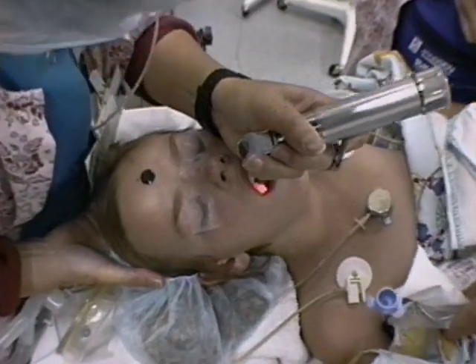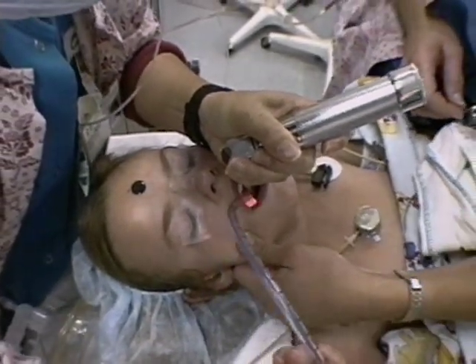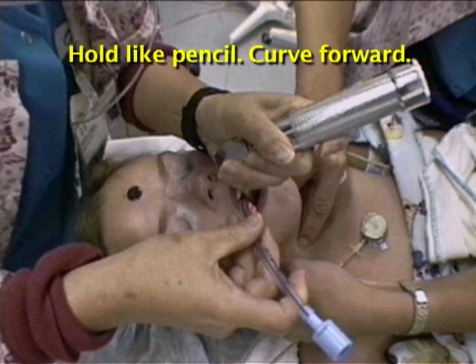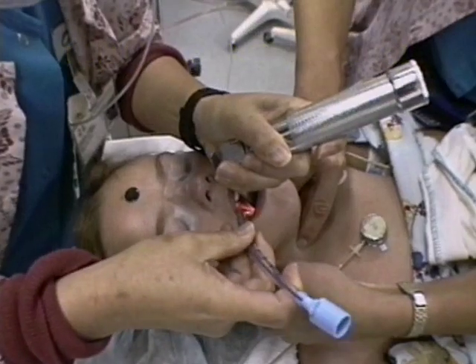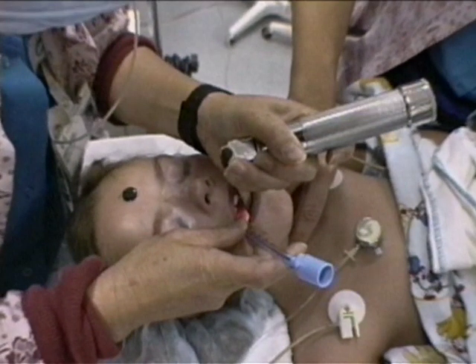Pick up the tube with your right hand. You can also ask your assistant to hand it to you in the correct orientation for insertion. Hold the pre-selected tube in your right hand like a pencil, curve forward. Keep your eyes on the trachea and maintain control of the blade. Insert it to the right side of the mouth and watch it pass through the vocal cords.